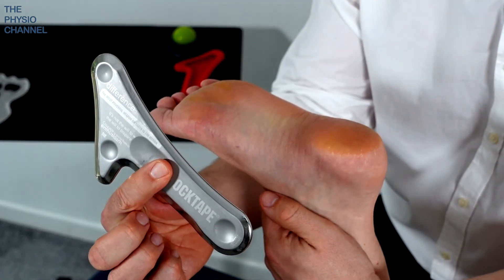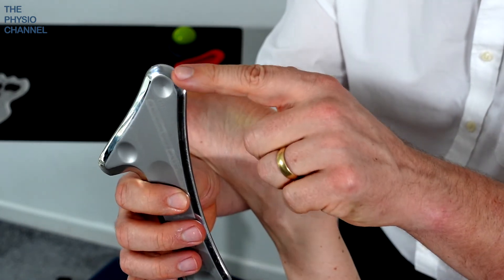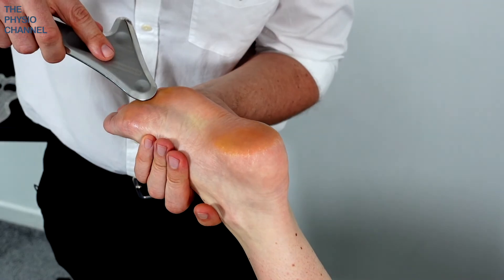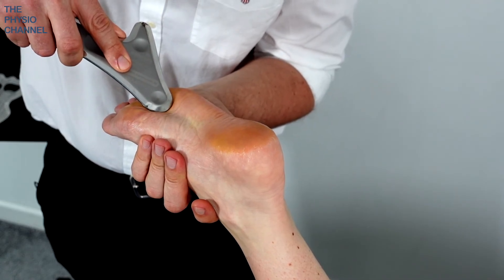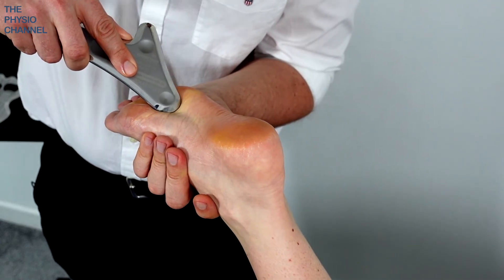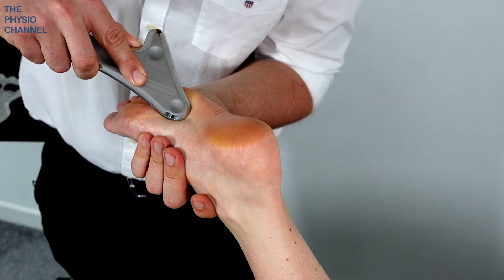If you have a different shape tool to hand, like the rock tape mohawk here, you can use one of the pointy edges to deliver a slightly more targeted treatment. Drop down between the metatarsal heads and come down through the centre of the sole of the foot, maintaining the pressure primarily through the tip of the tool.